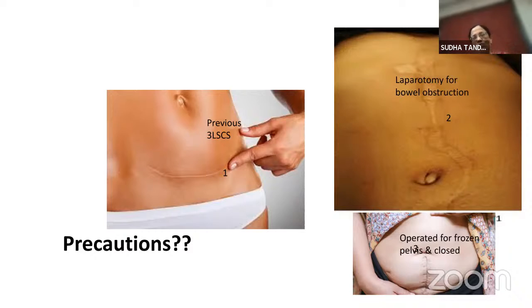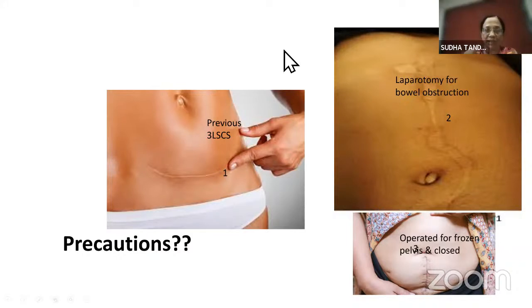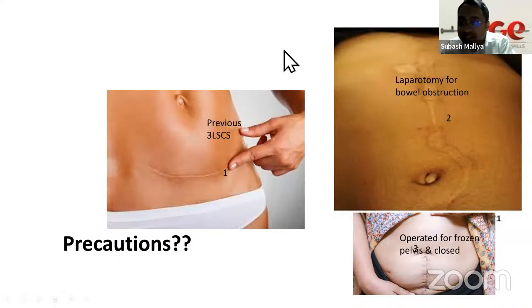You can also use an open laparoscopy method, but open laparoscopy in obese patients becomes a little difficult. Yes, ma'am. And in thin patients, it is safer to do an open laparoscopy. May I just, with permission of Jyoti ma'am, ask this question to Dr. Vandana Jain also? Like, let's hear from a different perspective.